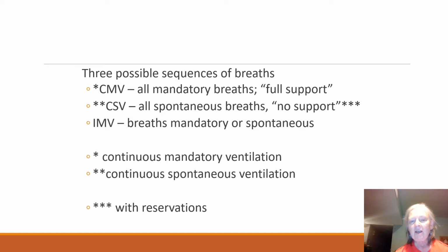Well, good morning and welcome to the second half of the ventilator. We're going to talk a little bit today about the types of breaths we have, how they're delivered, a little bit about alarms, a little bit about apnea backup, things along that line, and then the last slide is actually your assignment for today, so it should be kind of fun.